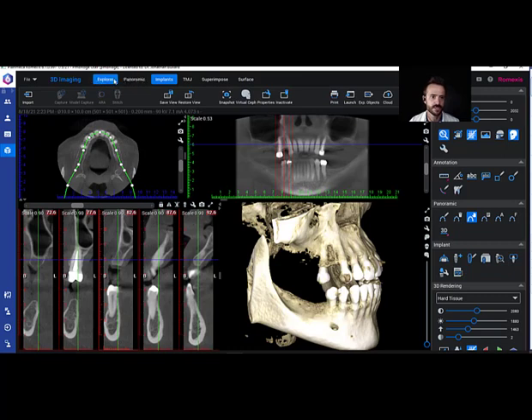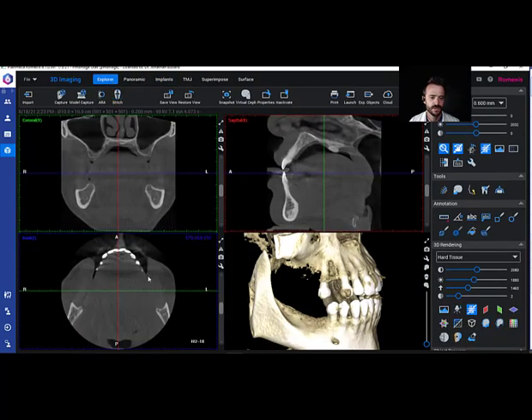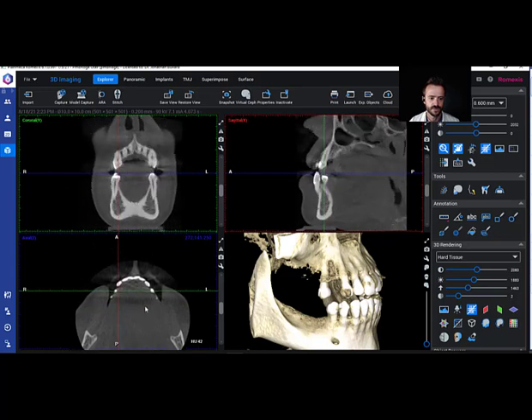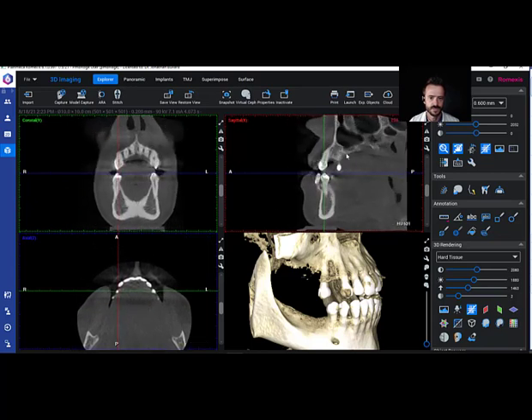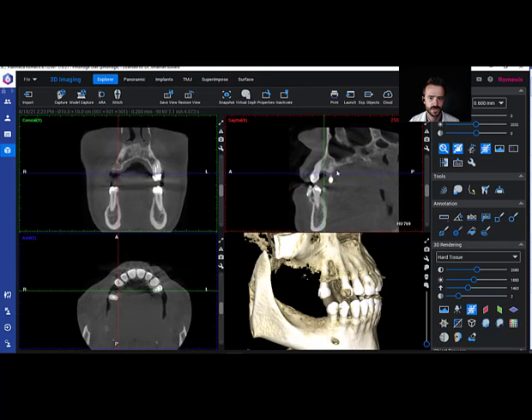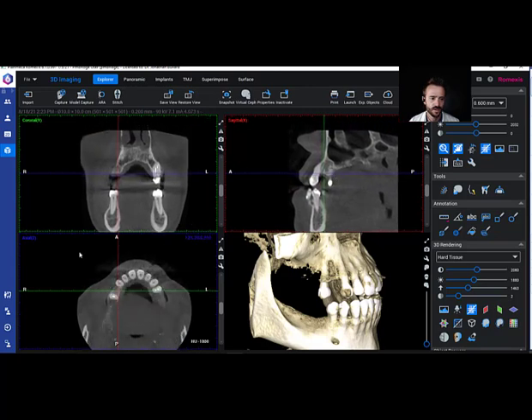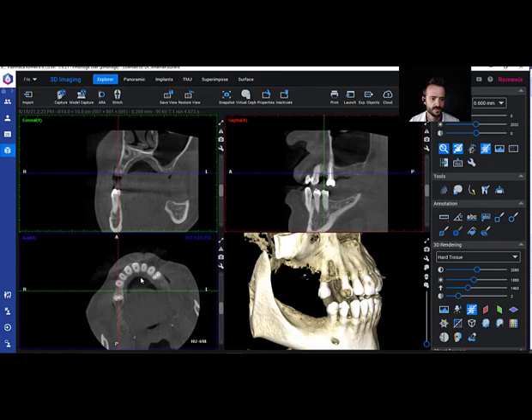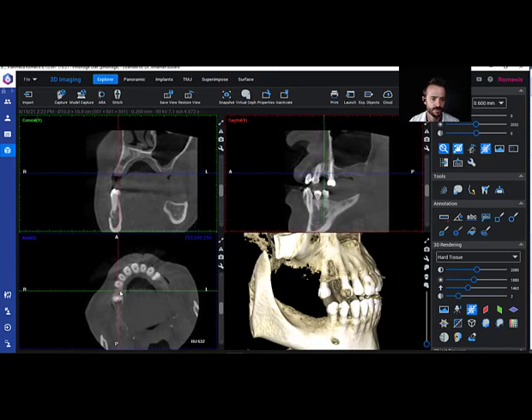I don't use Panoramic very much, or TMJ or the others, but we do use the Explorer view. If we're in Explorer view and wanted to look, we're going to left-click, and since it's on the patient's right I'm going to slide over to the right side. Then I'm going to go up to the sagittal view and drag down, and in the axial view I'm going to hold the right mouse button and rotate.